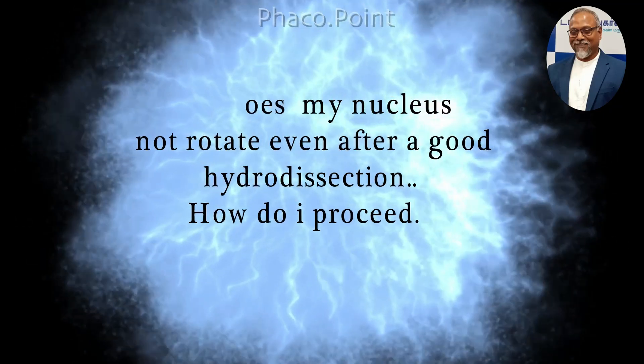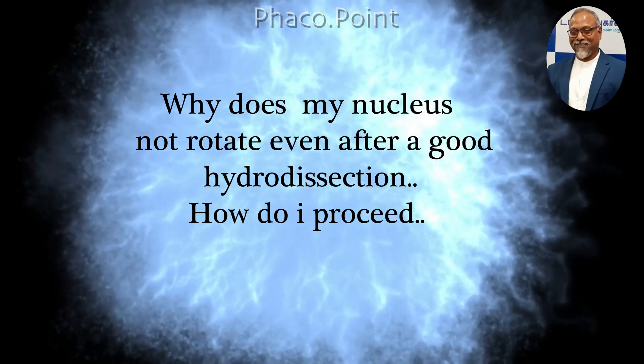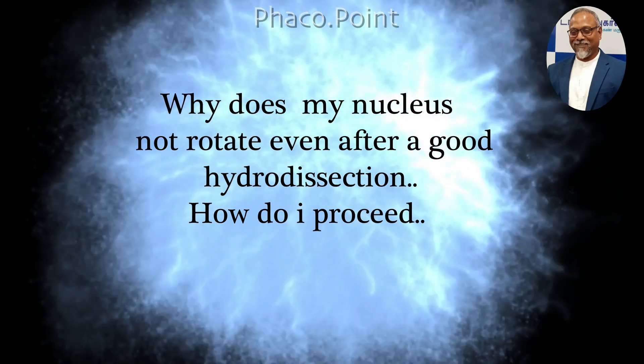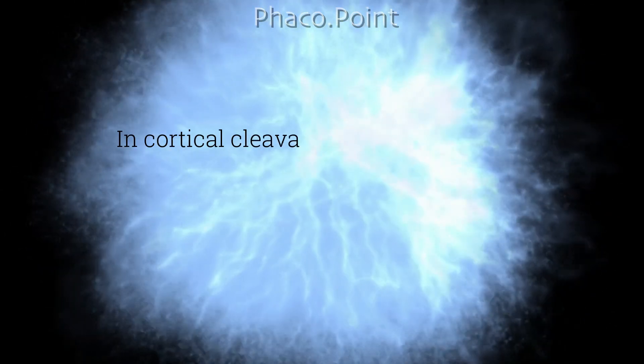Hello friends, have you ever wondered why the nucleus fails to rotate even after you performed a good hydrodissection? If you are wondering what could have gone wrong, let me try to explain the concept.